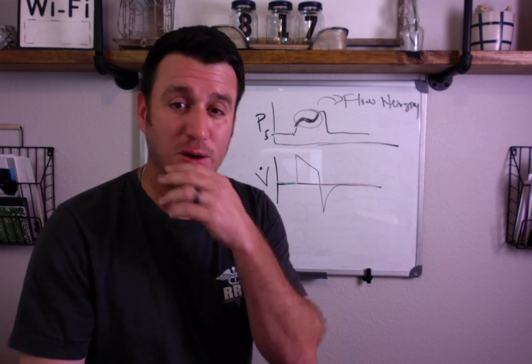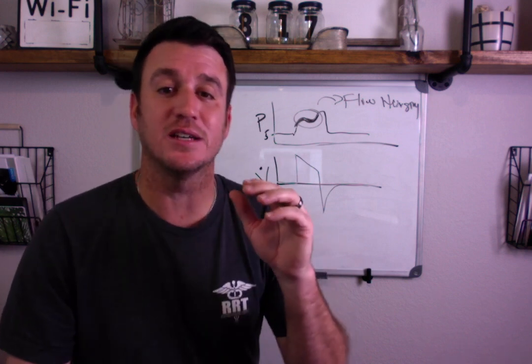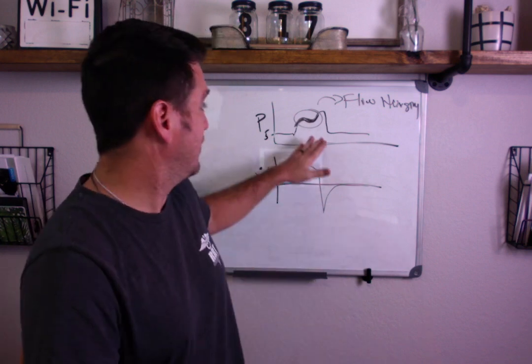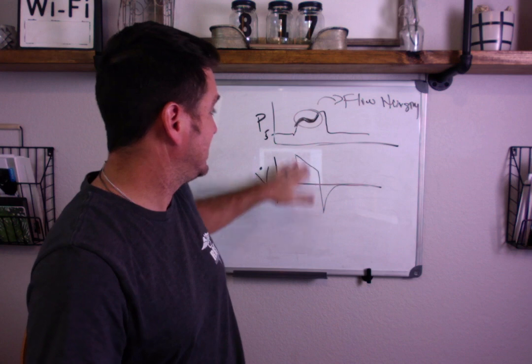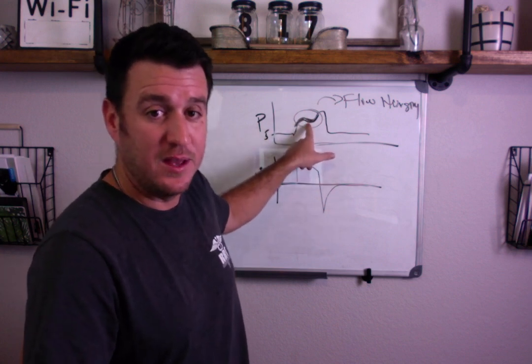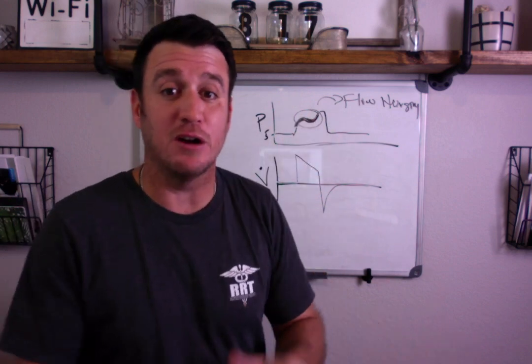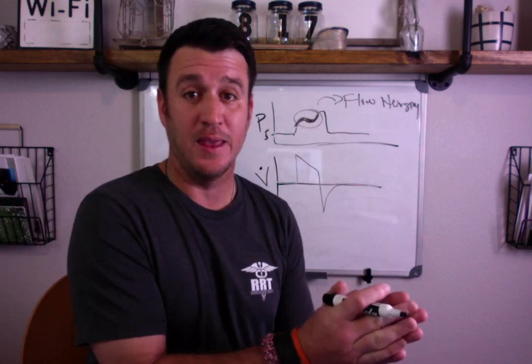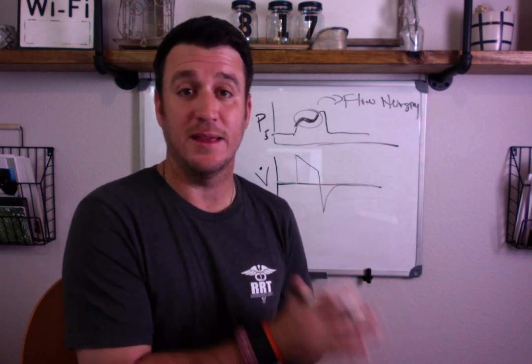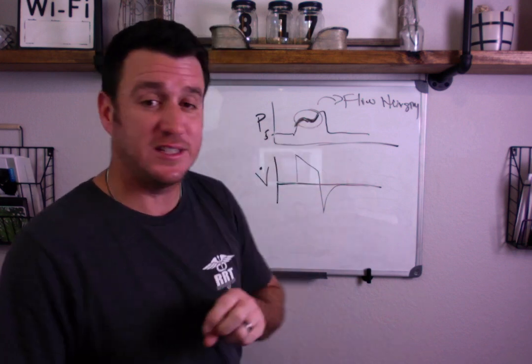I've increased the flow literally, guys, no joke. Some people are probably going to watch this and go, this guy's lost his mind. But if I told you that we had a patient with a severe flow hunger problem, this is exactly what we saw. It was more exaggerated than this, but we had a flow hunger issue. We were set on 60 liters per minute. The patient was breathing 40 plus times a minute. They were not happy. This was the pattern every single breath.